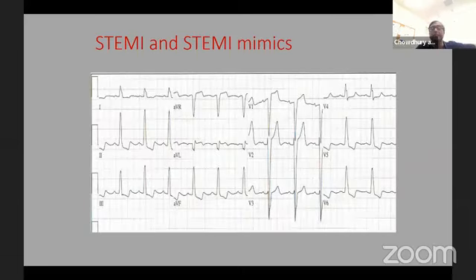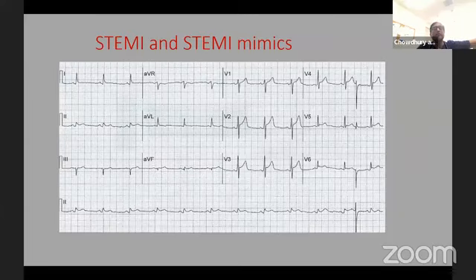The patient with left bundle coming with COPD exacerbation. And there is an alternative reason, an old EKG possible. So the ST elevation does not look like ST elevation MI, and the clinical picture does not fit in. This is ST elevation is there.